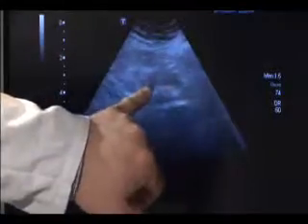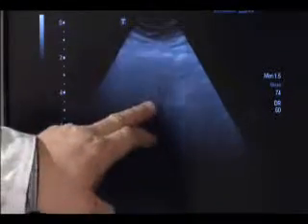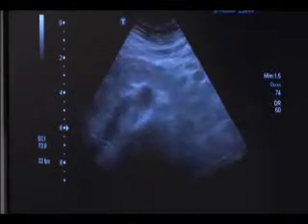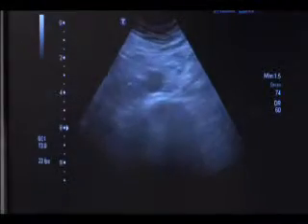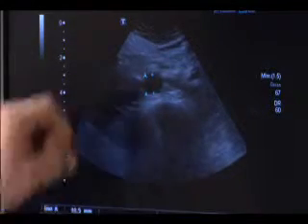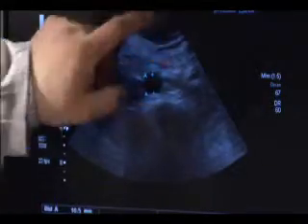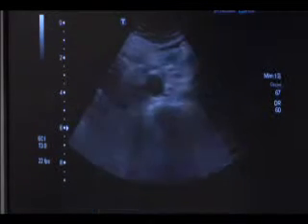This is where it splits, normally around the belly button, which sends a vessel out to the right leg and the left leg. We'll scan the entire length of the abdominal aorta and take a measurement of that vessel at its largest section. If there were an abnormality, instead of a small hole — which in this case measures a little over one centimeter — with an abdominal aortic aneurysm, we would see a much larger hole that's three centimeters or larger. And that's it for AAA screening. That's easy.